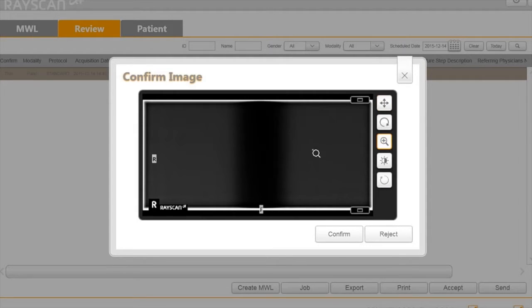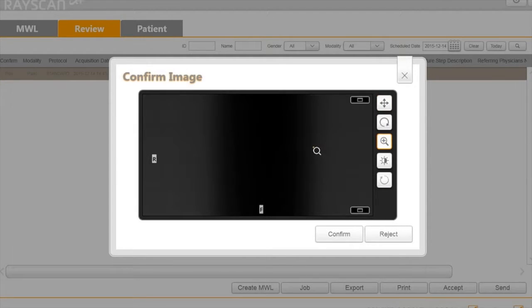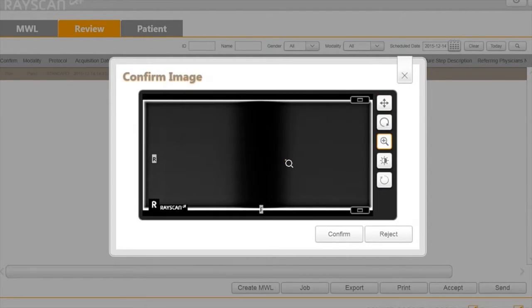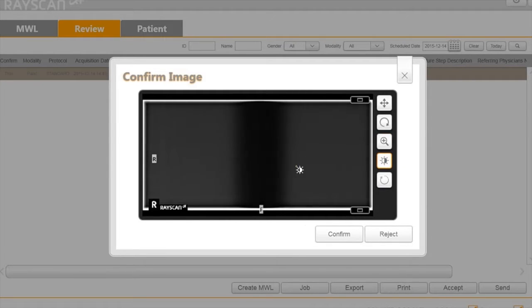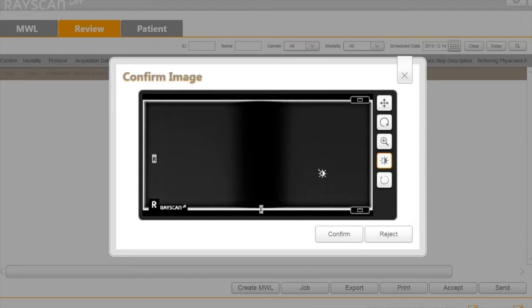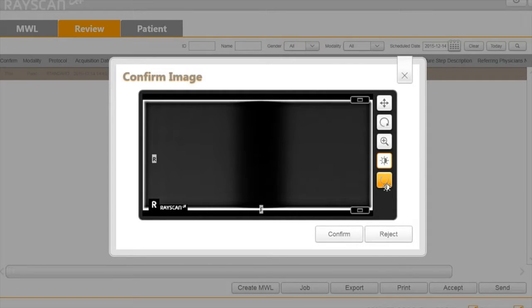You can also use Zoom. The Windowing button allows the user to click and drag on the image to adjust brightness and contrast. You can also reset the adjustments.